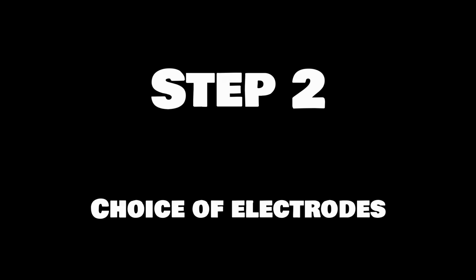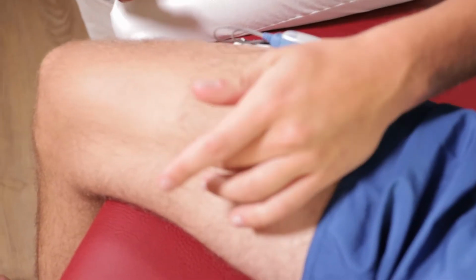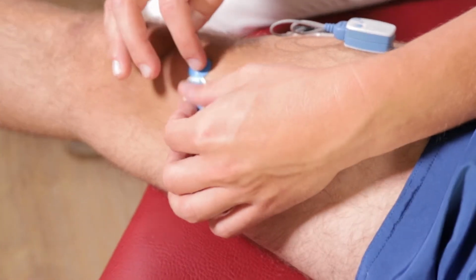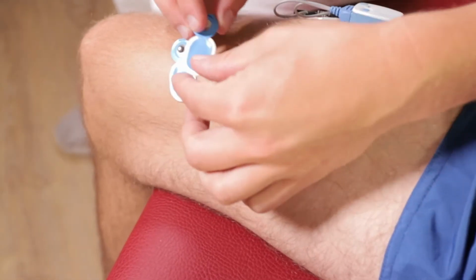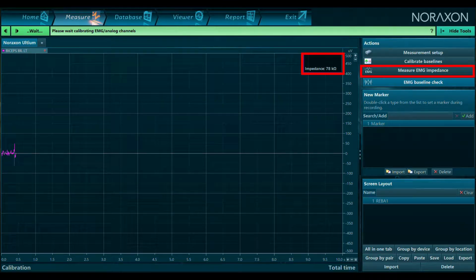Step 2. Choice of electrodes. The quality of your electrodes is essential for your measurements. Make sure that you check the impedance of your electrode of choice accurately. State-of-the-art EMG amplifier technology has integrated functions to do so.